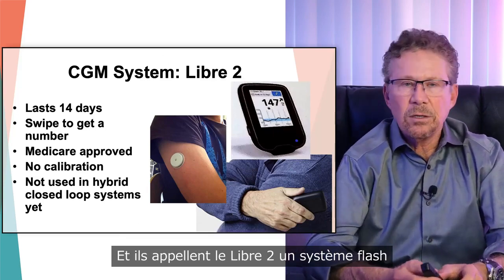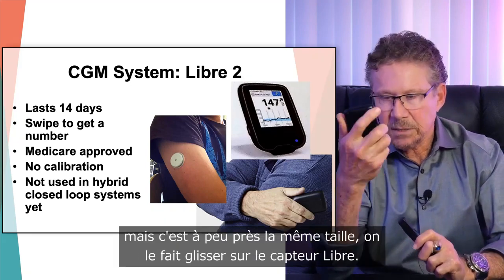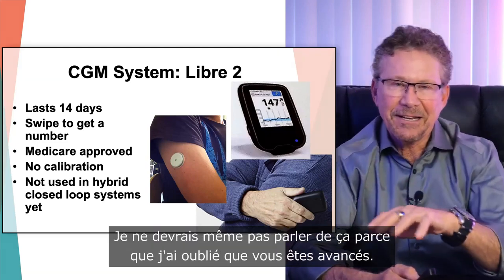And they call the Libre 2 a flash system because the monitor, which this is not it, but it's about the same size, you swipe it over the Libre sensor. So if I have to tell you that, I shouldn't even be talking about that because I forgot.